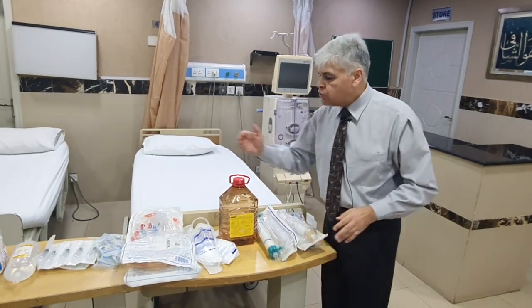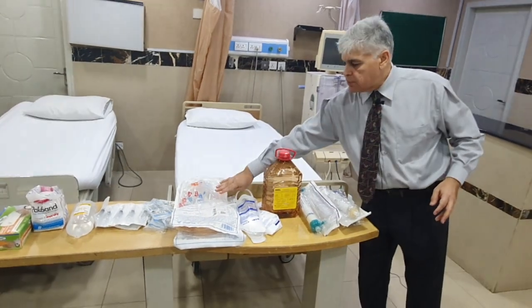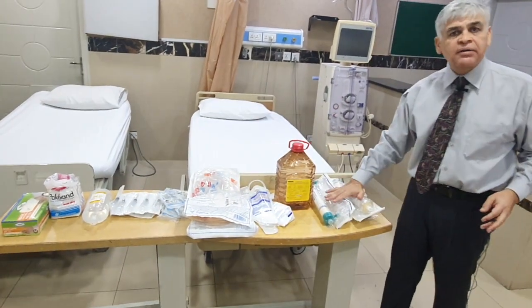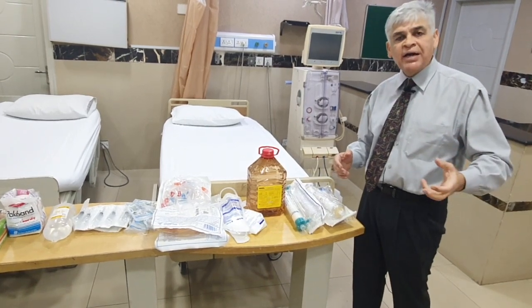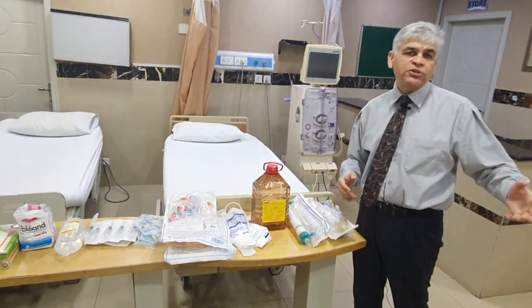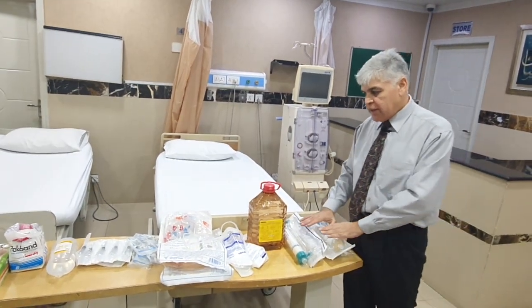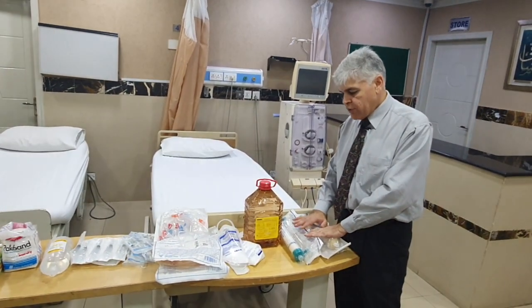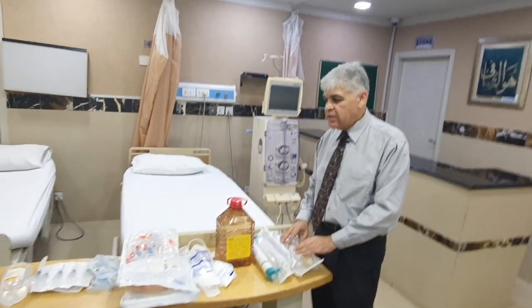So you need to make sure that you've got the right blood tubing line, the right dialyzer. For example, if somebody required a 1.8 dialyzer, they may not require a 1.8 in future. They may require perhaps a 1.4 or a 1.3, and so that's how you have to make sure that you use the right disposables for every dialysis session.